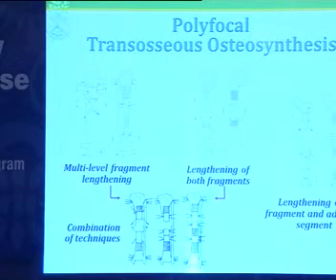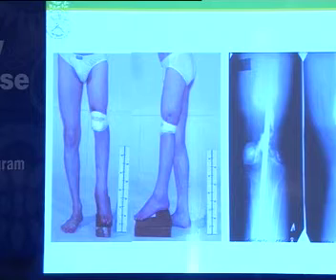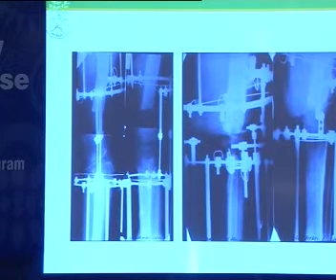The schemes of the polyfocal transosseous osteosynthesis. Patient's diagnosis: pseudarthrosis of the femur, intramedullary nail, osteomyelitis. 14 cm of shortening, true defect of 20 cm. Fistulography. Sanation surgery with fragments, sequestral necrectomy, and fixation of the femur and tibia using the Ilizarov apparatus.